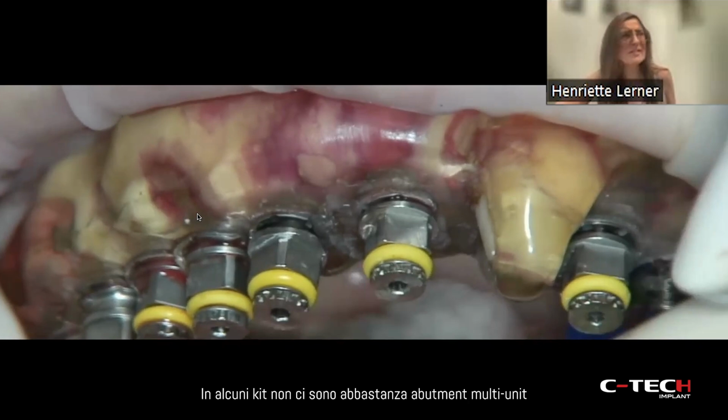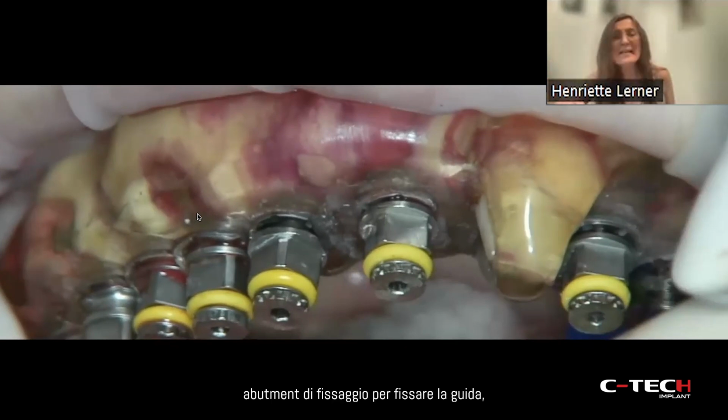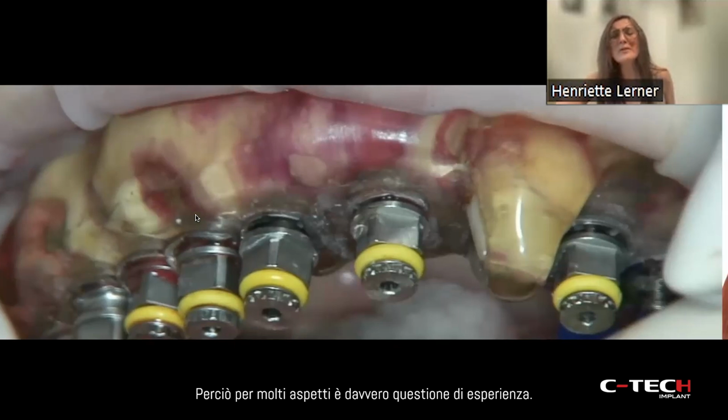In some of the trays, you don't have enough multi-unit, not multi-unit, fixation abutments to fix the guide. So you have to order separately. So there are a lot of things that only the experience shows you.